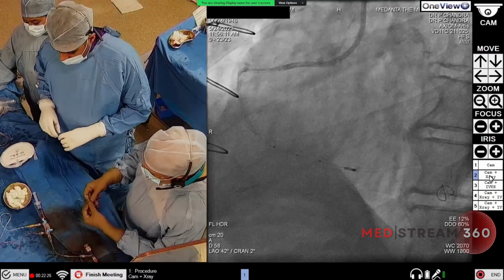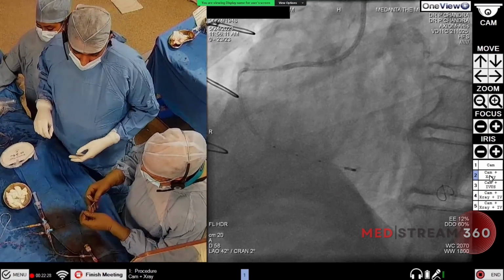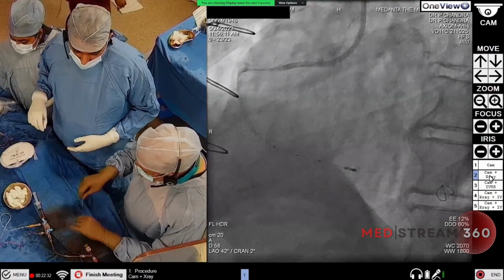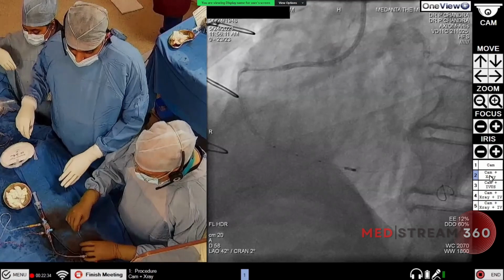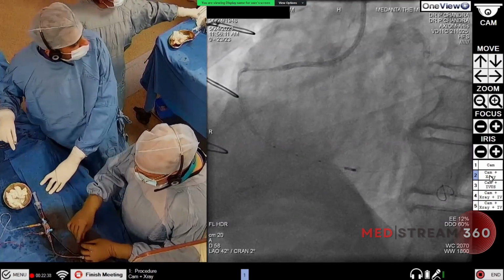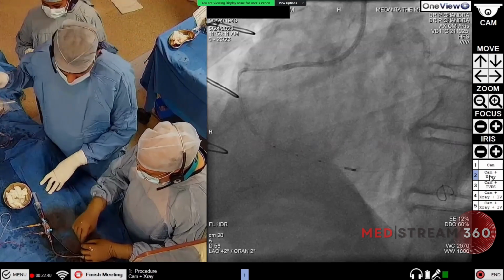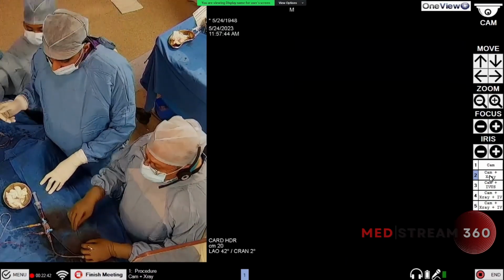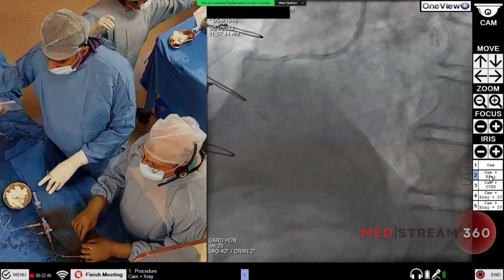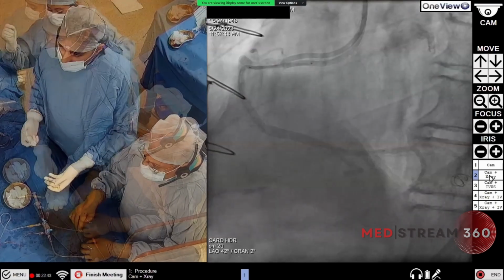Yes. So we need to take a stent which has an open cell design, and also we have to know in each cath lab which stent has what. We gain that experience, and of course with the data as well, that side branch protection is something which should be kept in mind all the time.